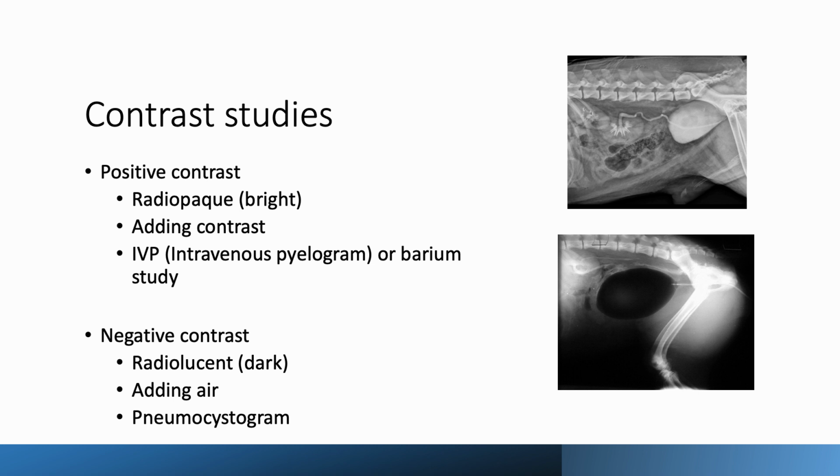Sometimes there's a double contrast study, and what this means is that we're using both a positive contrast and a negative contrast together. So we could have both of those added for some sort of imaging.